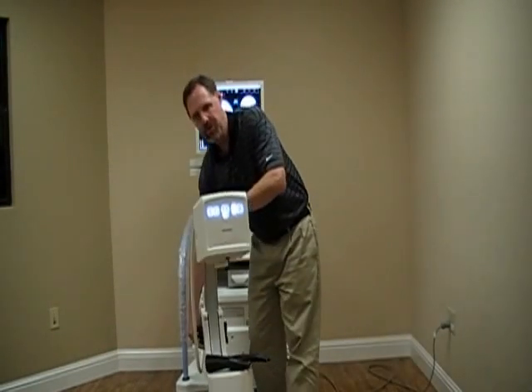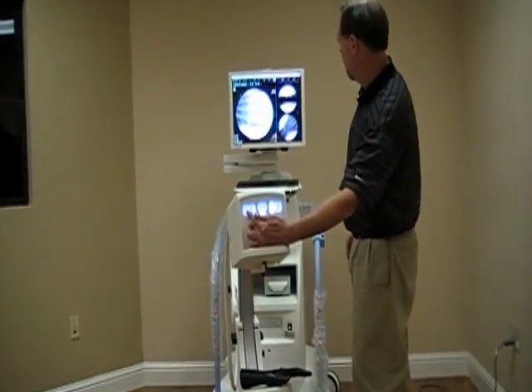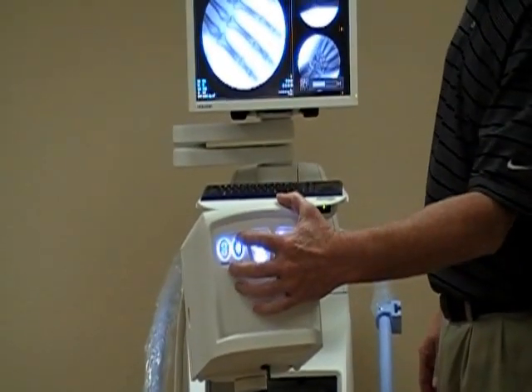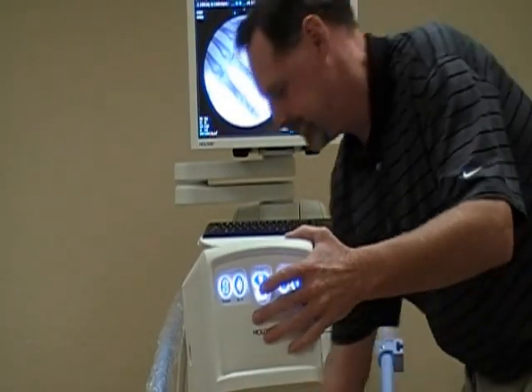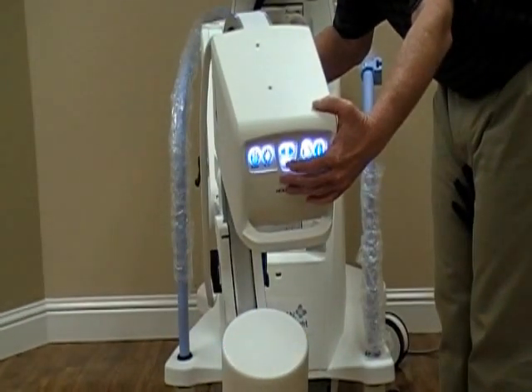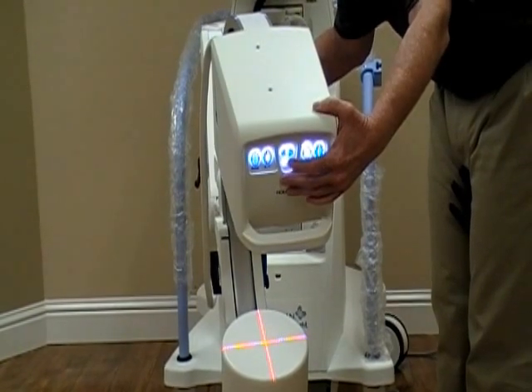There are also physician controls on the head. We can rotate the image here. We can adjust brightness and contrast here — it's going to make the image brighter or darker without taking another image. The laser pointer gives us the laser; if we push and hold it until it blinks, it'll stay on for the duration of the case.